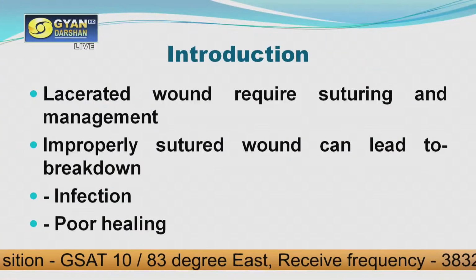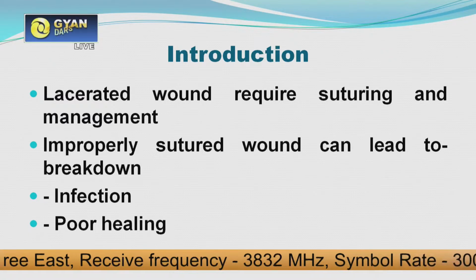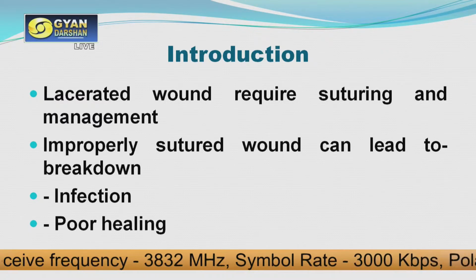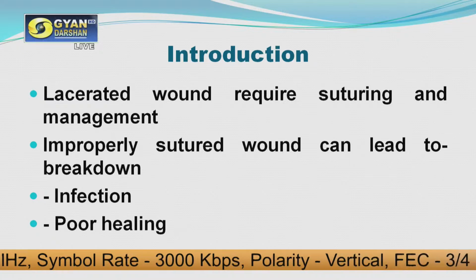As you know, lacerated wounds require suturing and management. Also, if the wound is improperly sutured, it can lead to breakdown, it can lead to infection, and it can also lead to poor healing. So this is very important to remember, that if you do not take care of the wound properly, it can lead to further complications, and the patient will have to pay a lot for that.